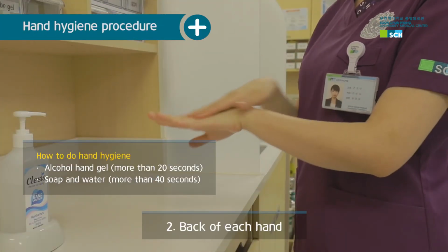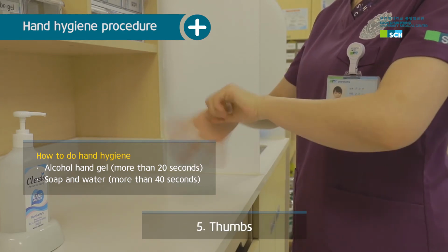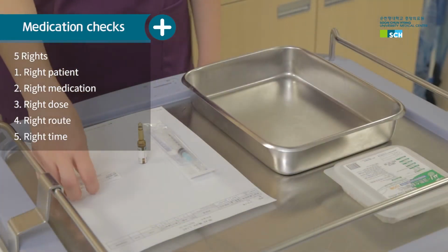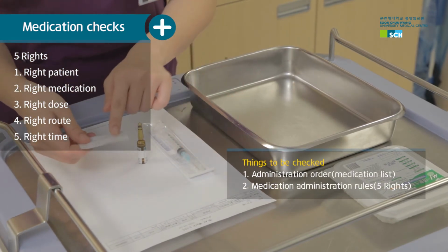Perform hand hygiene. Prepare necessary equipment and supplies. Prepare the injection by checking the medication list and the medicine label accurately.